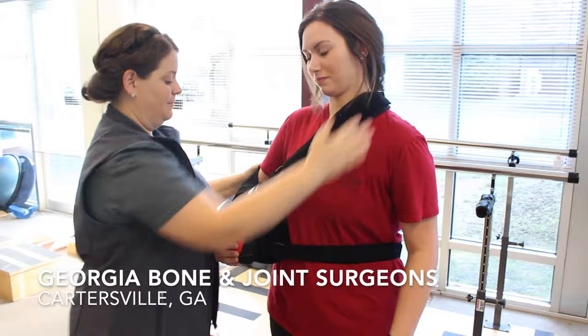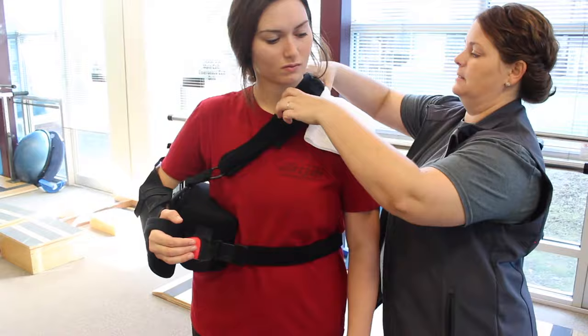If the shoulder strap becomes uncomfortable around your neck, you can place a towel under the shoulder strap for extra padding.